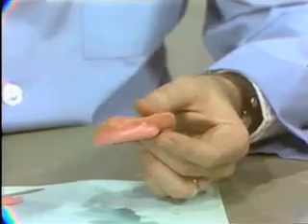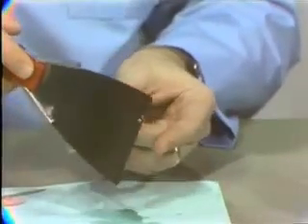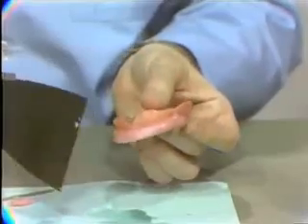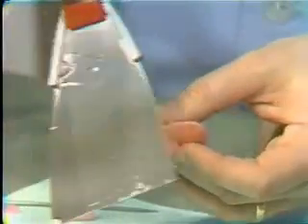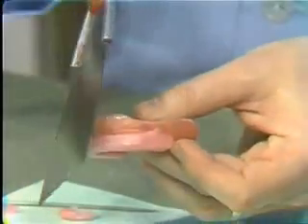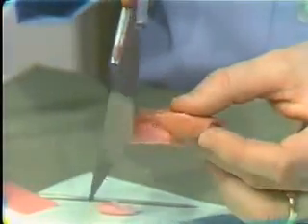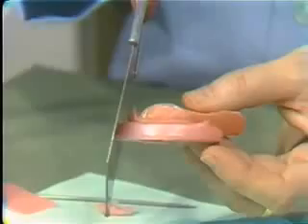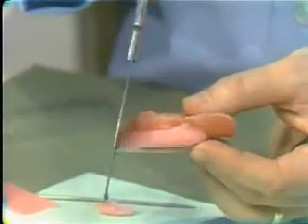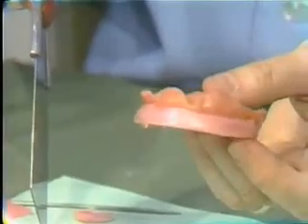Actually, in the patient, some extra time is spent in actually contouring the anterior part of the wax so that it gives us a guide when we start setting teeth. That is, we know the labial inclination that we want to give the teeth that give the proper support to the patient's lip. So actually, in the clinical case, we would be doing this at chairside, going back and forth, contouring this until the lip support is desirable to the patient and to you.